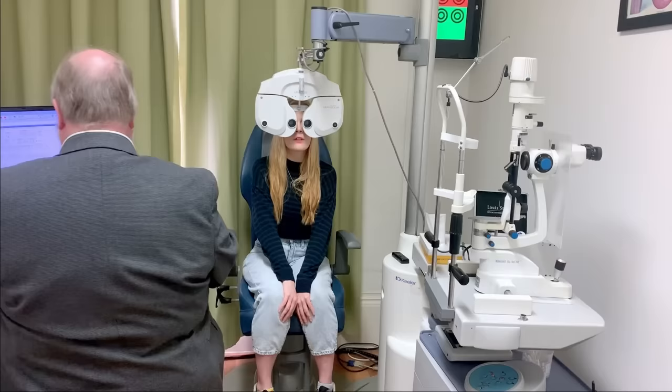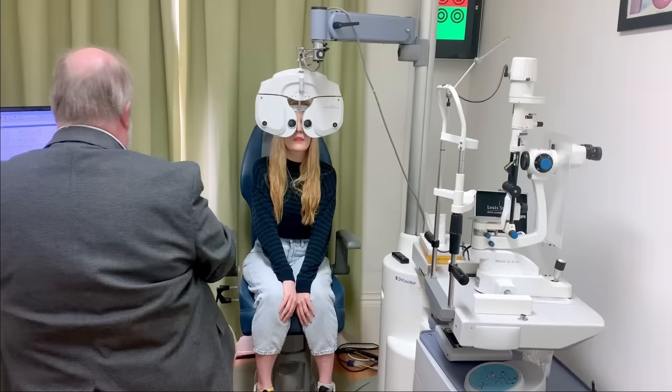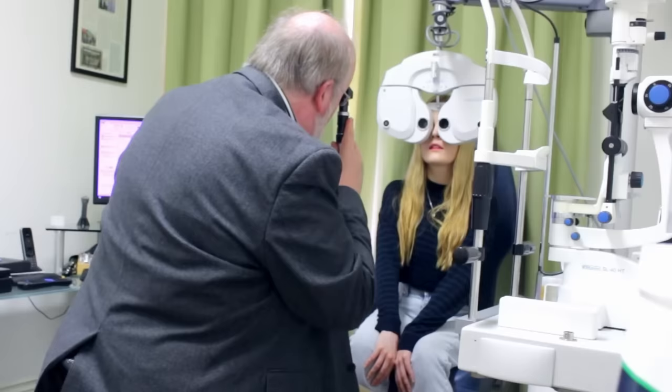I'm going to shine a bit of a light into your eyes, okay? Okay. It won't be that bright, but I just want to have a little look and see what your vision's up to first. There we go. So look at the green for me. Nice and blurry though, isn't it?